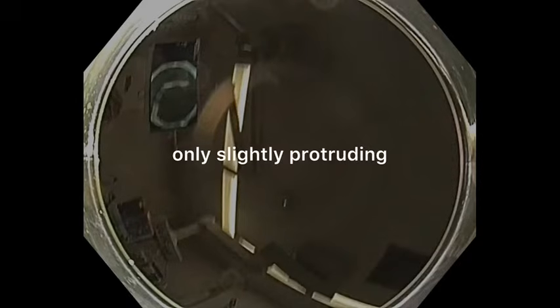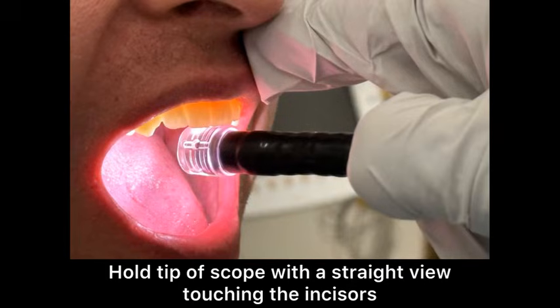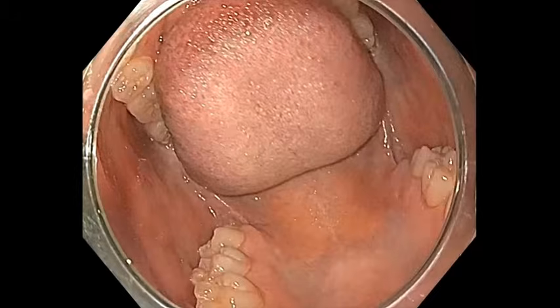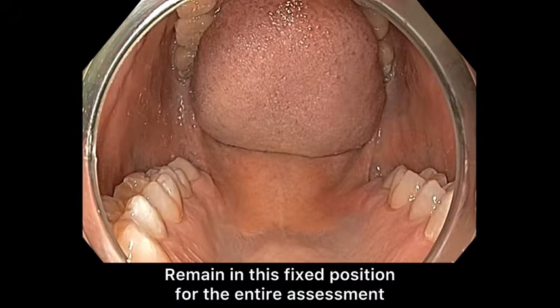We will now demonstrate correct cap position. Adjust the cap for centered views, with the cap only slightly protruding. Find your ideal scope position. Hold the tip of the scope with a straight view touching the patient's incisors. Rotate the scope tip to achieve centered views. Remain in this fixed position for the entire assessment.